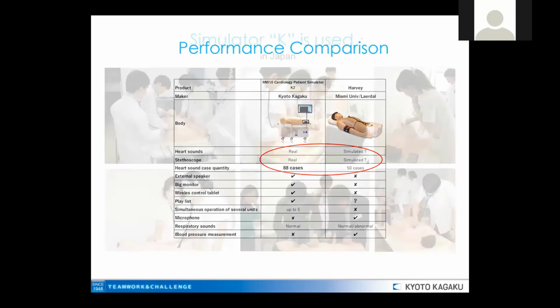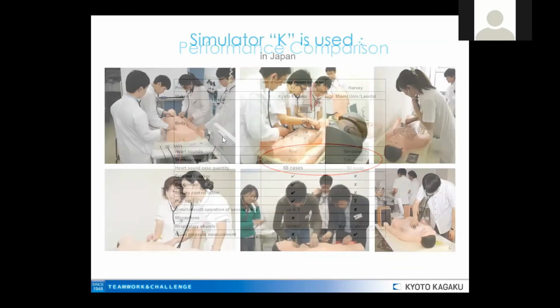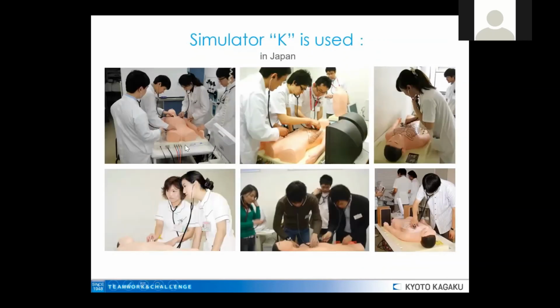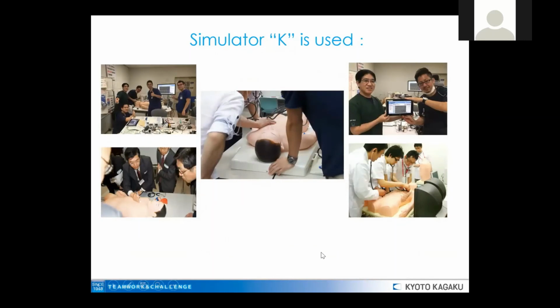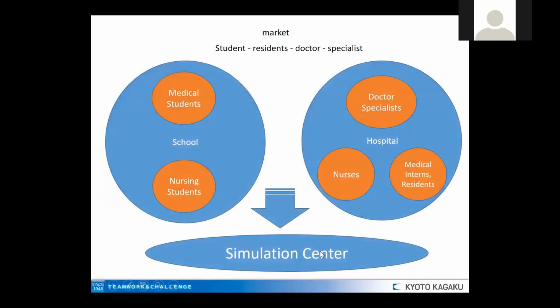So because of this, the model has been used in Japan for many years, since we launched the very first version that you can see here in these pictures, until, well, nowadays with the new one.